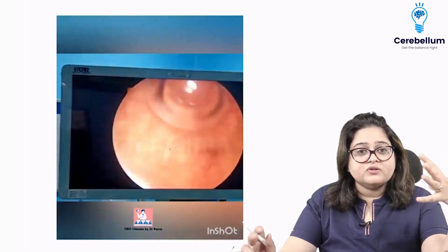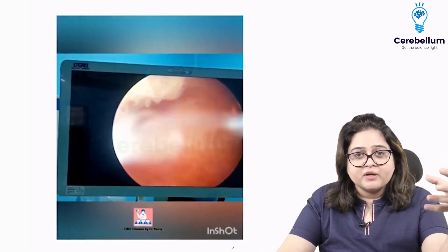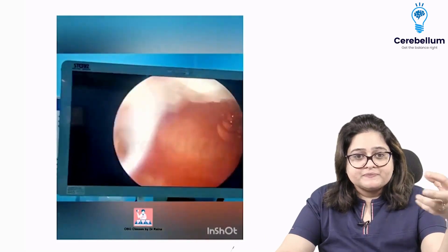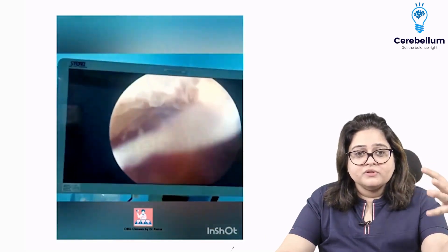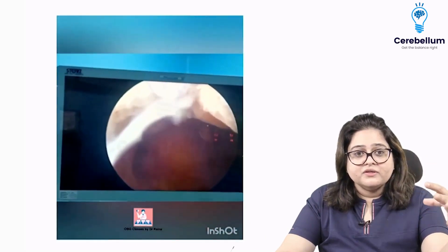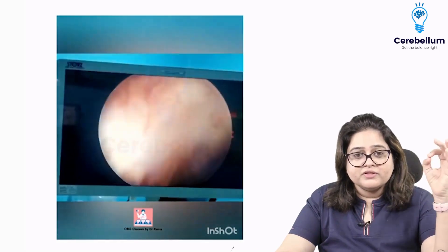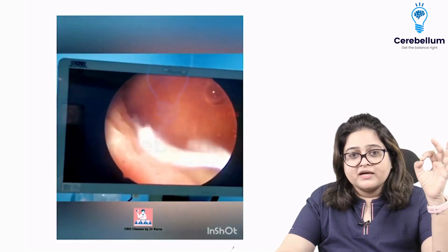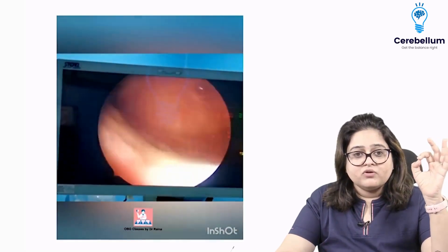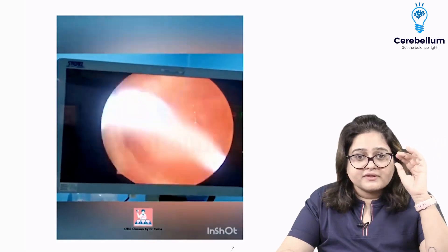And that is a normal cavity. You can see a little bit of air bubbles which I've entered, but this is a normal looking uterine cavity on a hysteroscopy. So that's how a normal hysteroscopy looks like.